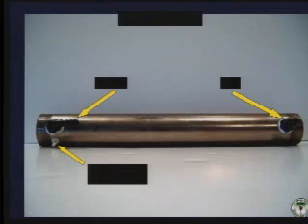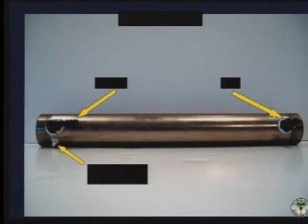And that's the sample chamber. It's a pipe about 7 inches long, has a diameter of about a 25-cent piece. And the sample chamber is 81 cubic centimeters. When you look at the printout on the machine, it says your grams percent of alcohol related to 210 liters of lung air.